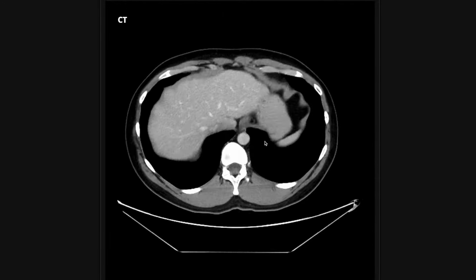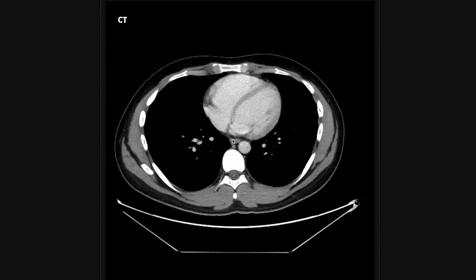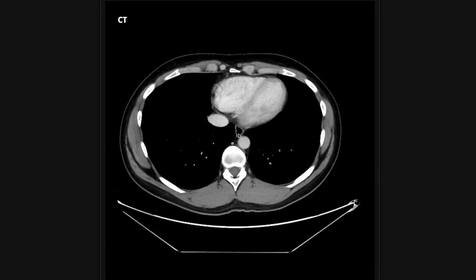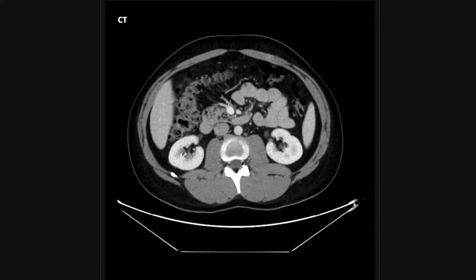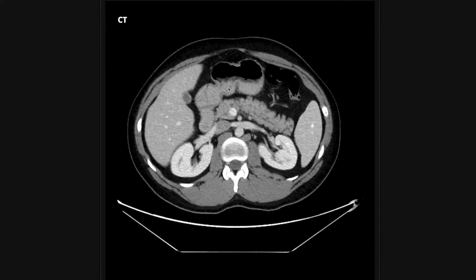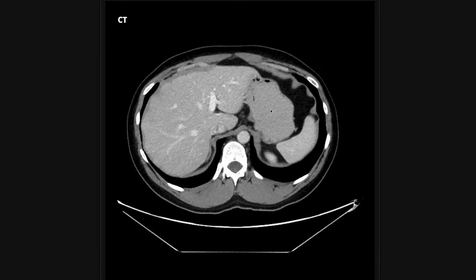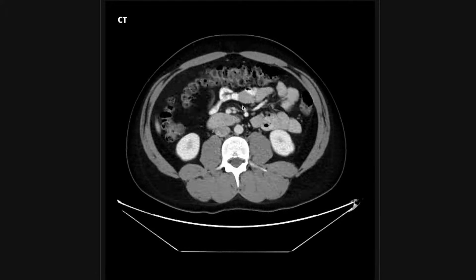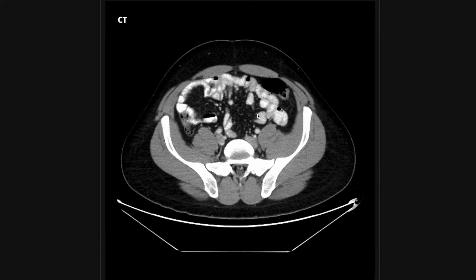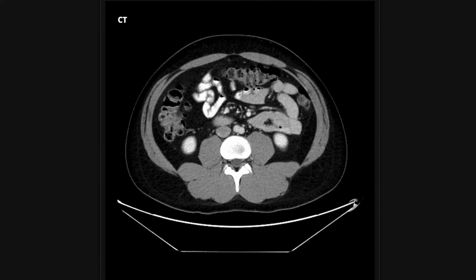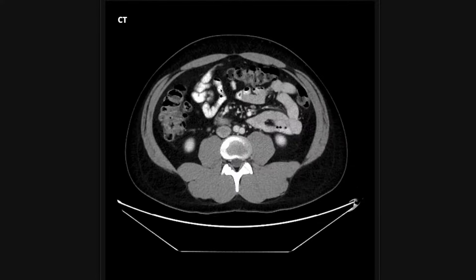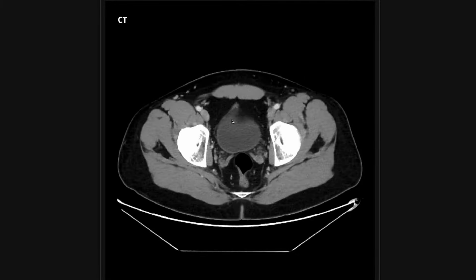I then go back to the axial and look at the upper digestive tract, starting with the distal esophagus next to the aorta, tracking it down into the stomach. I look for thickening of the stomach wall and inflammatory changes that could suggest gastritis. I then look at the small bowel — in this case it's filled with oral contrast — and check that the small bowel is not dilated, which would suggest a small bowel obstruction.